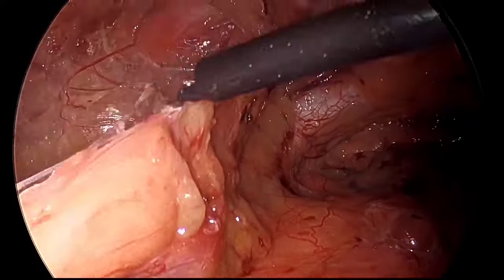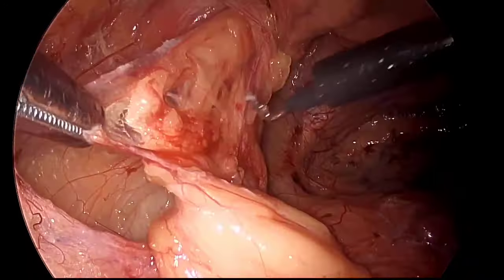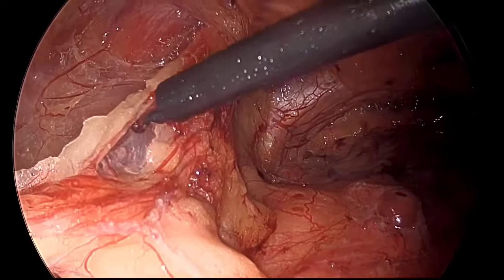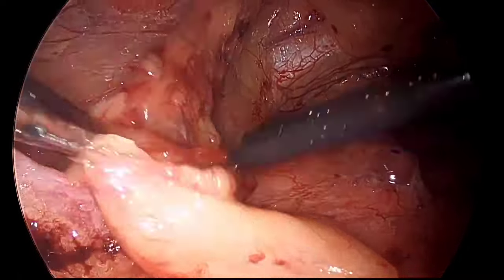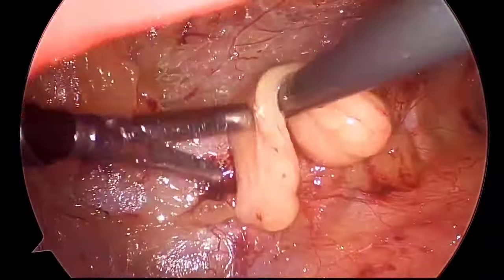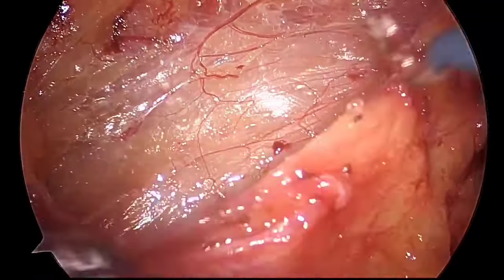So you have to differentiate between the two things. One is cord lipoma and one other is fatty cord. So sometimes cord structures are engulfed with or entangled with fatty tissues. Sometimes we tend to confuse whether it's a cord lipoma or a fatty cord structures. So that we have to differentiate while doing the dissection. In case of cord lipoma, we should dissect it off, but in case of fatty cord structures, we should not dissect, because while dissecting those fatty tissue, we may injure the gonadal vessels or the vas deferens.